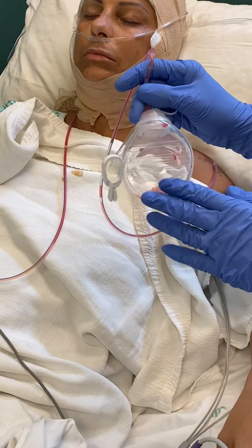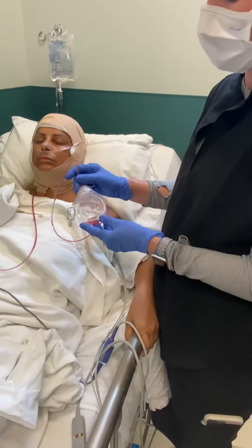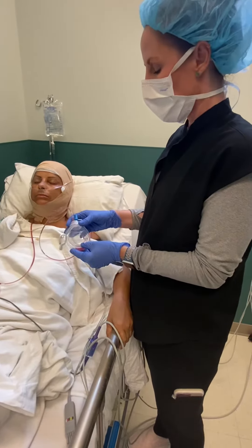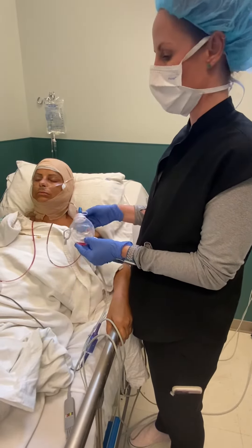You want to make sure that you're washing your hands before and after the drain care. This isn't a sterile technique but it is a clean one, so you want to make sure that your hands are clean. Wash with soap and water — sing happy birthday twice before and after you do this.